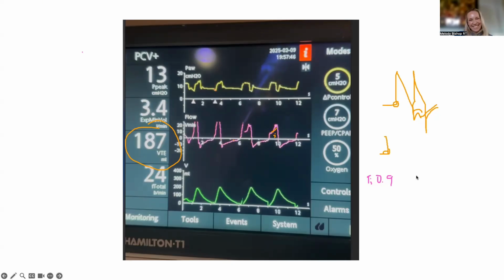So she wound up popping him on pressure support, exactly like what you did, and the patient wasn't breathing at all, because he was RASS -5, completely snowed to the gills. The SICU attending was very adamant that the patient was double triggering, and my co-fellow was like, this is not double trigger, it's reverse trigger. We need to bring the sedation down. He didn't believe her, so she put him on pressure support, and the patient didn't breathe for like 30 seconds. I don't remember if he actually wound up believing her, probably he just stuck to his guns, but that's one way you can prove it's a reverse trigger: pop the patient onto pressure support.